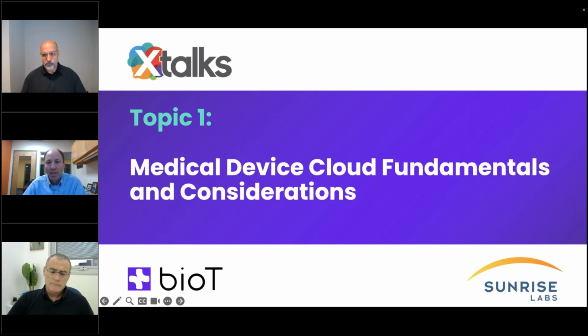So another thing that you have to really think about is what's the real value of the connectivity and the data, and to whom? The clinicians, again, are trying to practice medicine. They care less about your business model and the things that might help you, like being able to optimize your machine learning algorithms. They really want to get an actionable answer. So, keeping in mind that being connected can very much help that.